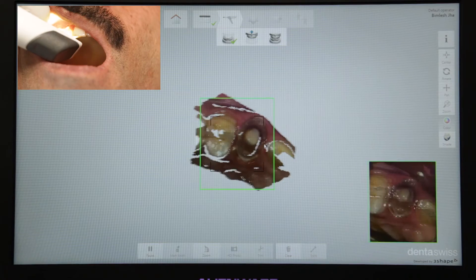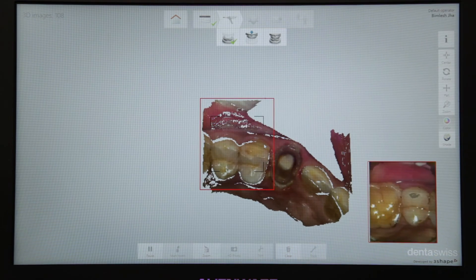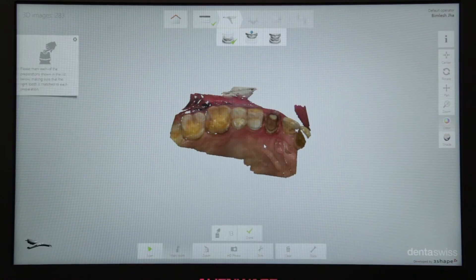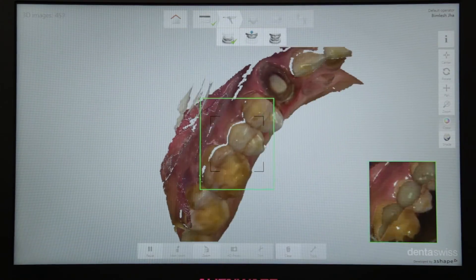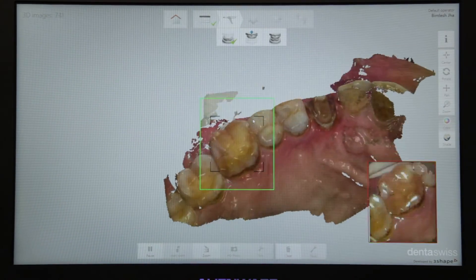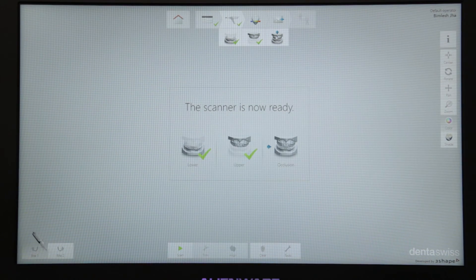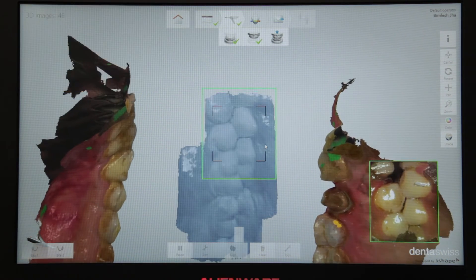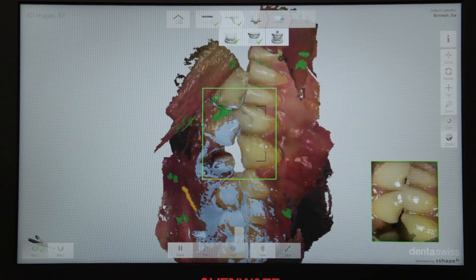Now similarly, the upper arch can be scanned. You also need to take a digital bite — just ask the patient to bite in Centric, activate the scanner and just wave it like a magic wand. It's simply amazing. You see it's now integrating the upper and lower scans according to the bite.